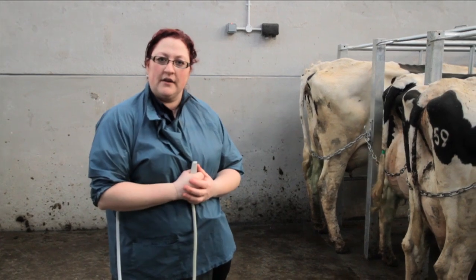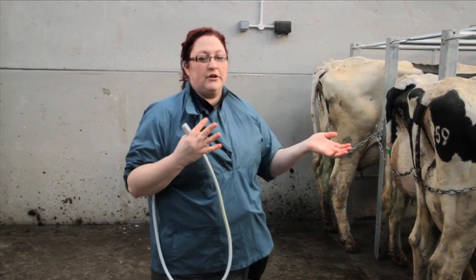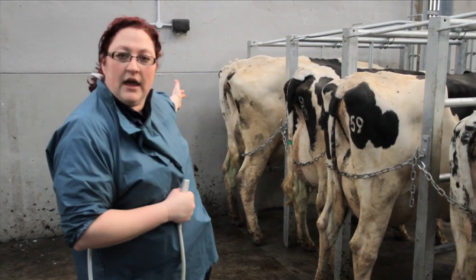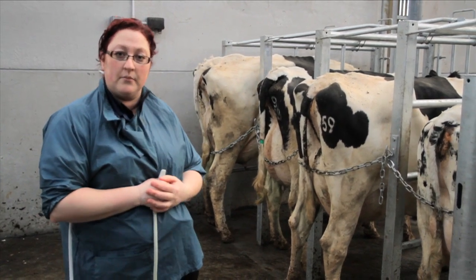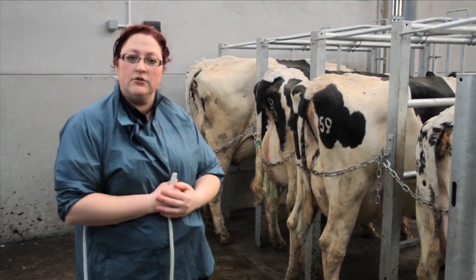Now we're ready to go and prepare our cows. We need to look at the environment that we have set up for scanning. Those largely depend on the farm that you're actually working at. This particular farm at Bristol University has dedicated purpose-built facilities, which actually makes handling very easy. What you mainly need to bear in mind is personal safety and also safety of the cows and the other staff members wherever you're working. In this particular facility, we have dedicated stocks or AI stalls where each cow can slot in individually and we have good access to perform our examination. You can also use locking head yokes or individual crusher stock facilities.